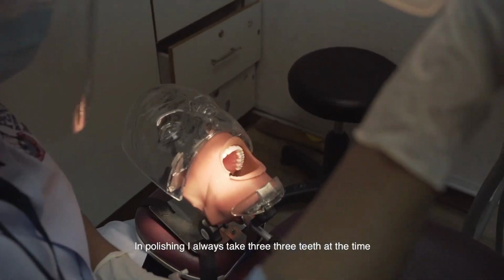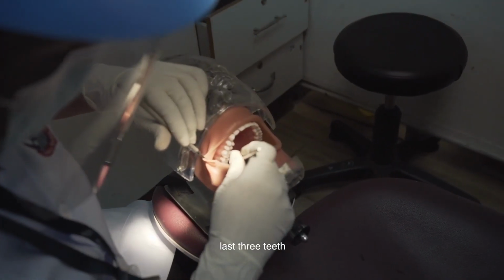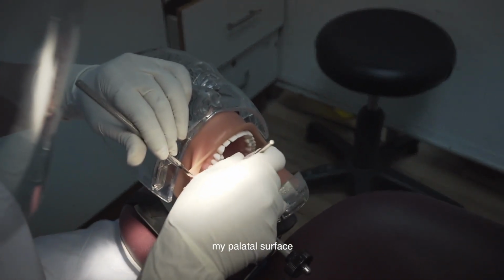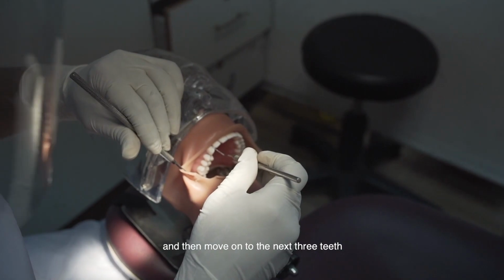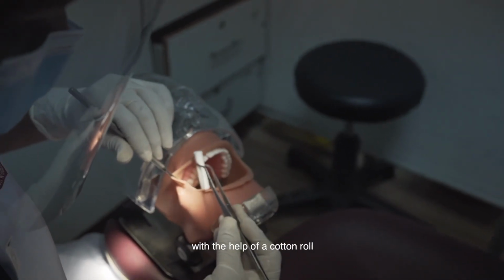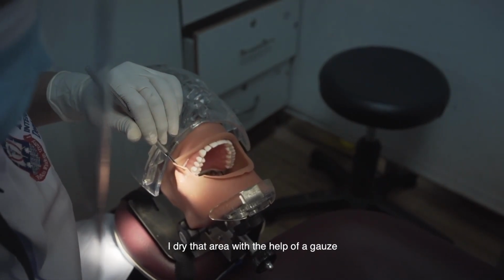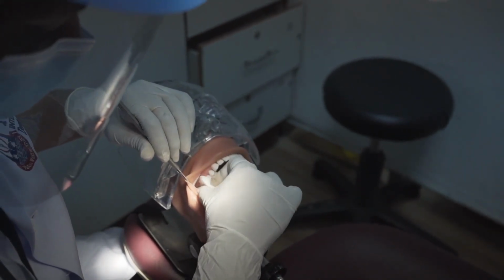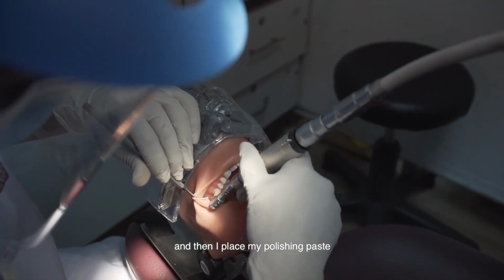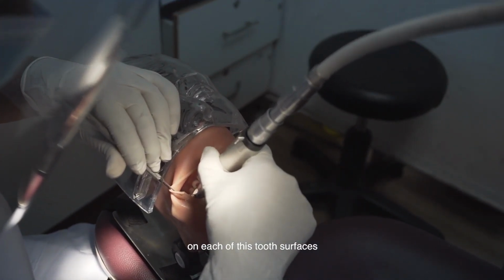For polishing, I always take 3 teeth at a time. For example, I start with my last 3 teeth. I do my buccal surface, my lingual surface, my palatal surface, and then move on to the next 3 teeth. When I am starting with that, I first try to isolate this area with the help of a cotton roll. I dry that area with the help of a gauze, and then I place my polishing paste on each of these tooth surfaces.